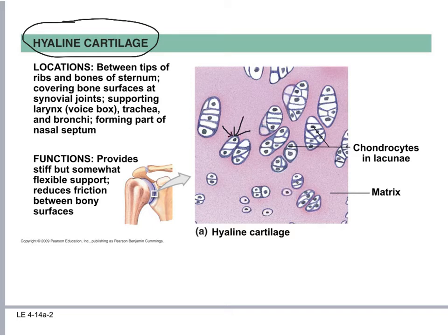So we've got a dark cell nucleus and a dark cell membrane, and they all end up looking like eyeballs. To me, these cells look like eyeballs. Sometimes the cells are packed together in groups, sometimes they are all by themselves, and sometimes they're only with one other cell. But the cell itself has a very distinct look when it's stained.